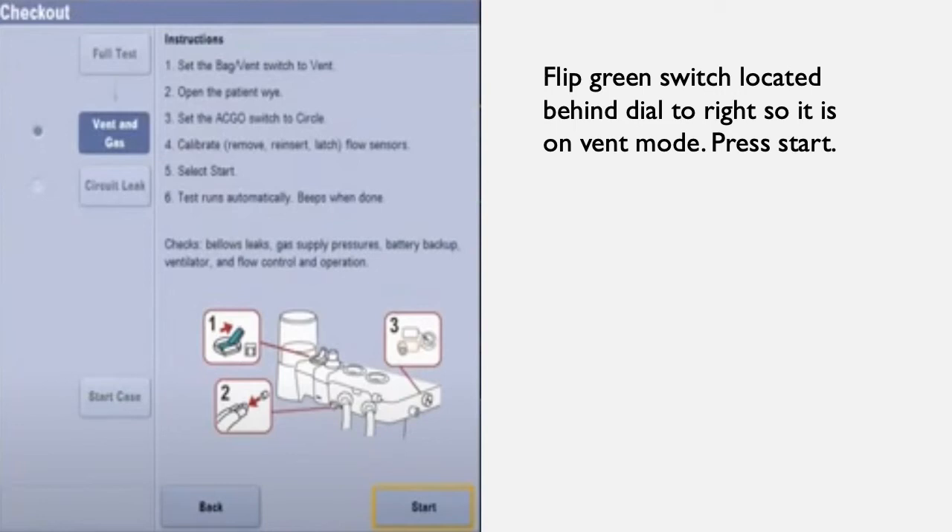Time will count down from about 15 seconds. If successful, the screen on the next slide will pop up.